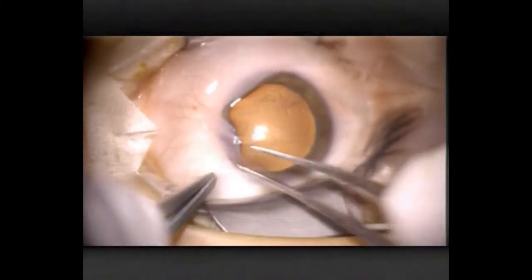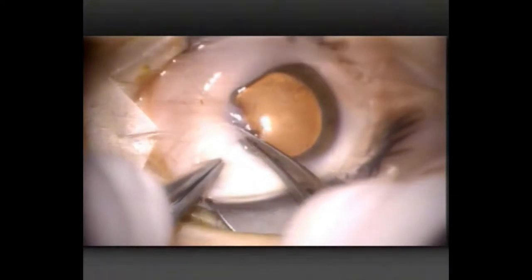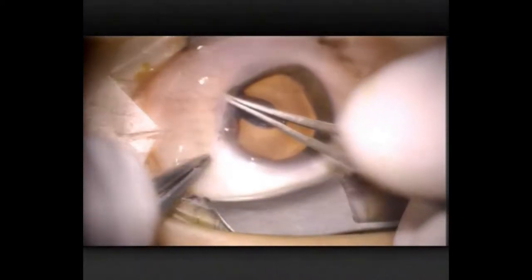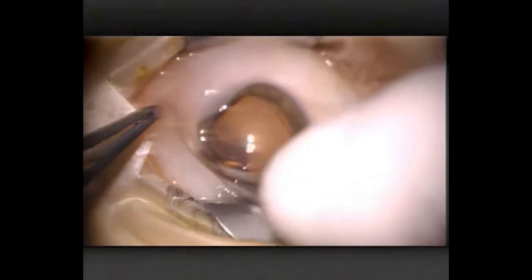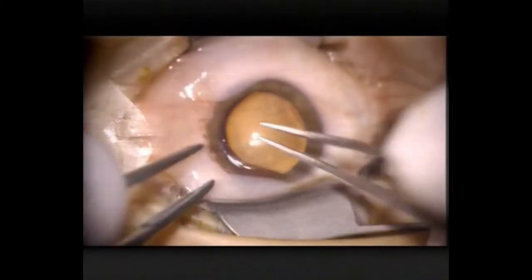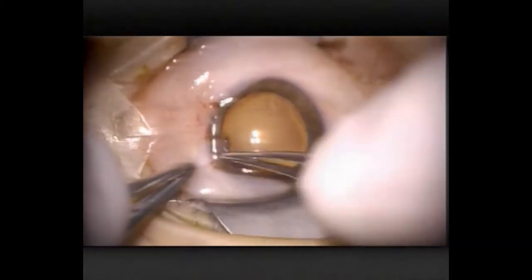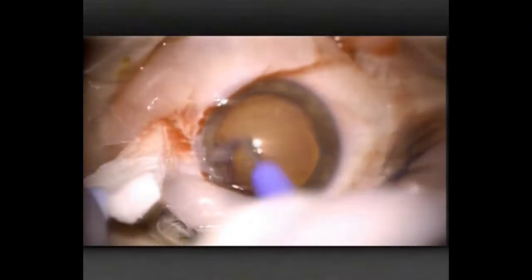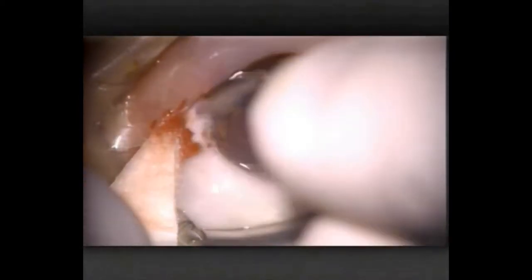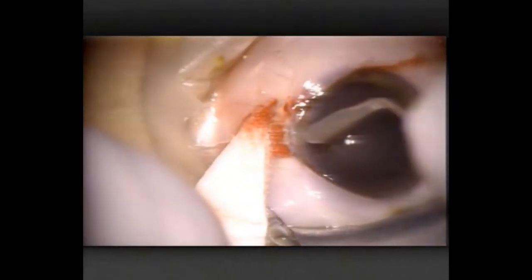I've found the most effective way to remove the pterygium from the corneal surface is this simple avulse and technique using a couple of non-toothed forceps — moors fields in my left hand and swan neck tying forceps in my right. You'll see there's two or three different points of adhesion, and once I've peeled or torn that from the surface, I then go in with a crescent knife, trying to make as smooth a surface as I can, in effect trying to maintain Bowman's layer and the original anatomy.